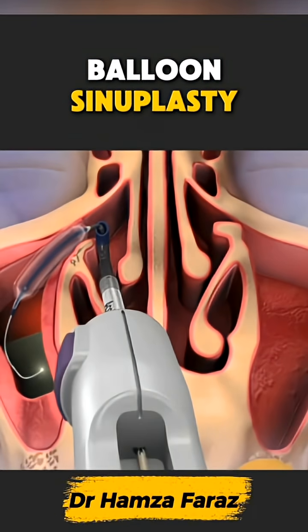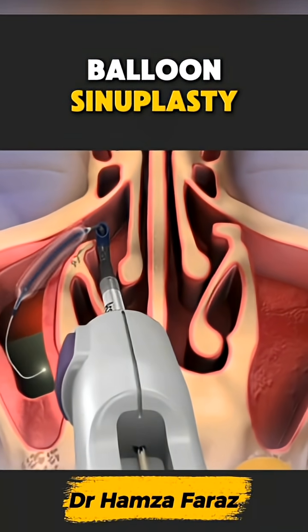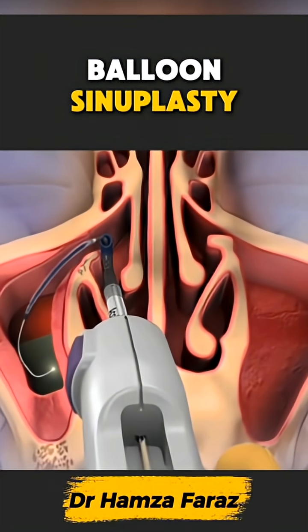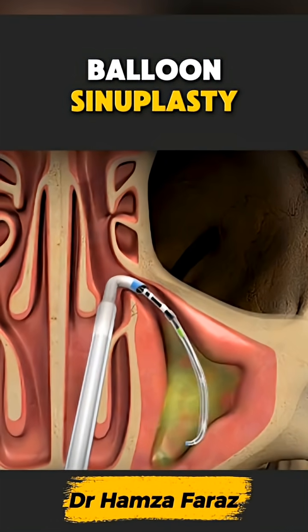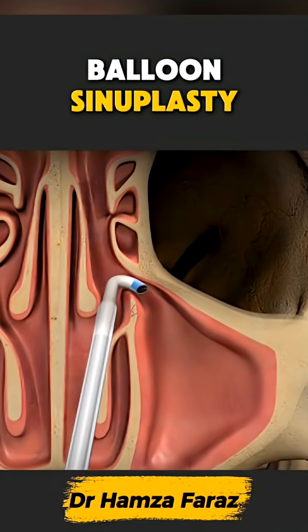After the opening is restored, the balloon is deflated and removed, leaving the sinus naturally reshaped. Most patients feel pressure relief almost instantly as their sinuses finally start to breathe freely again. A tiny balloon and a big return to comfortable open air flow.